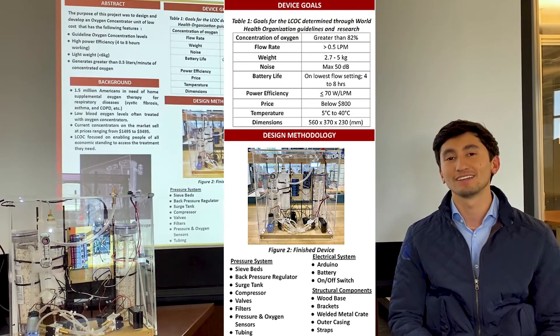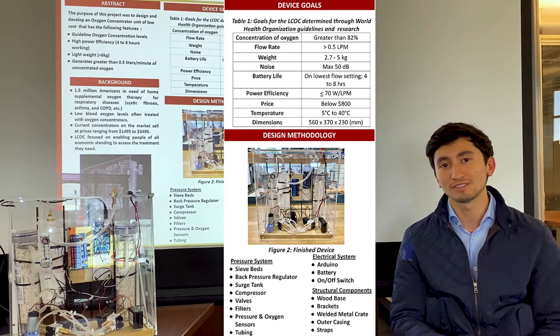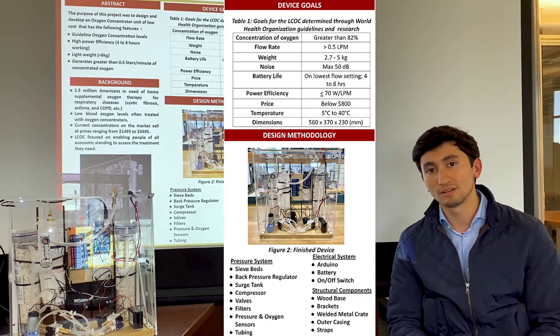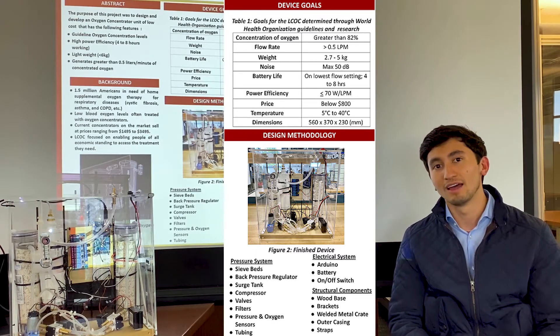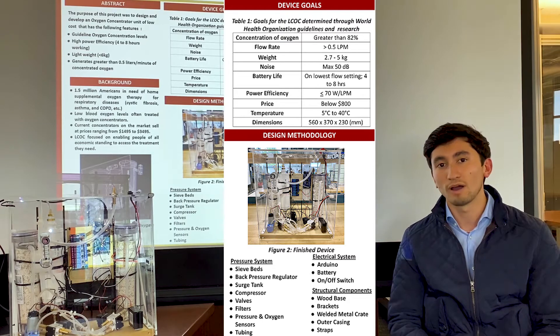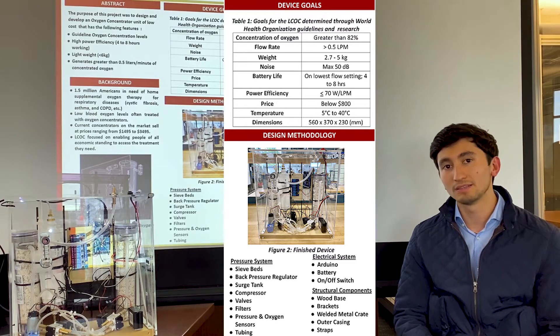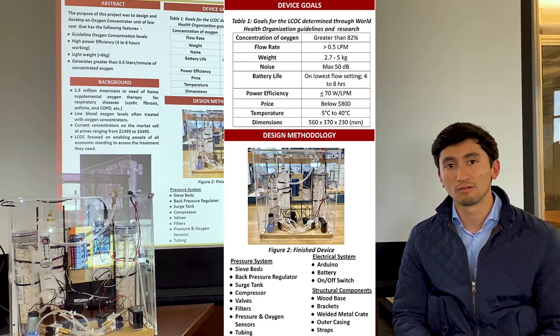In order to design our device, we divided it into three main subsystems: the pressure system, the mechanical system, and the electrical system. The electrical system included an Arduino IDE Mega 2560, a relay module, jump wires, and a 12-volt battery. The pressurized system included the sieve beds, the surge tank, as well as the valve system and the compressor.